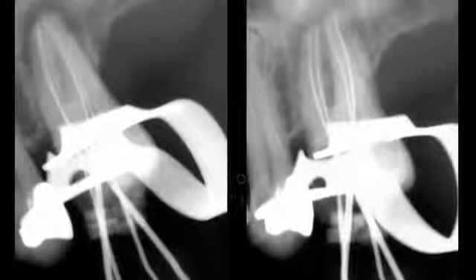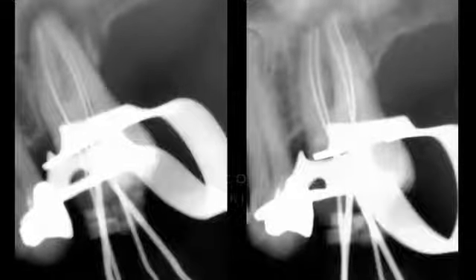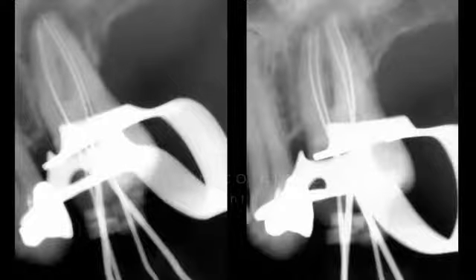The orifice of MB2 was located and prepared. Working length was established at the apical constriction with an electronic apex locator and confirmed radiographically.